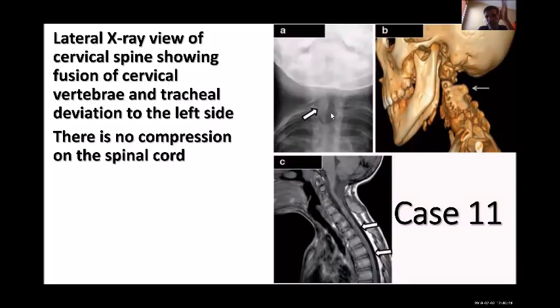Esophagus or the larynx, that area, like either the trachea or the esophagus, because the trachea is here. If you know how to do ultrasound to check the intubation, it's like a goose sign, if you heard about the goose sign, or double trachea sign. When you do an ultrasound of the neck to make sure that you're intubated, you look if you have one trachea or two tracheas. If you have two tracheas, that means your tube is in the esophagus, and the trachea has air.